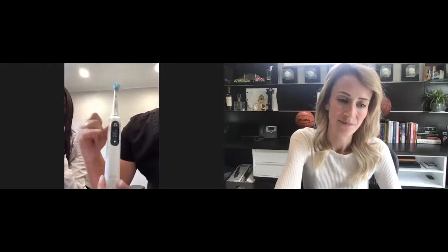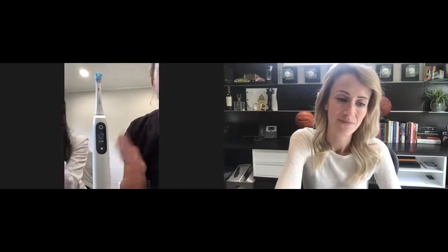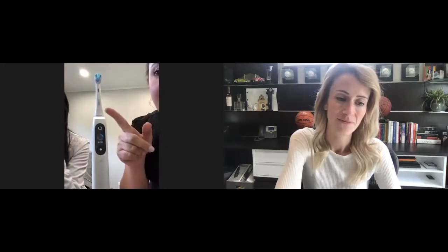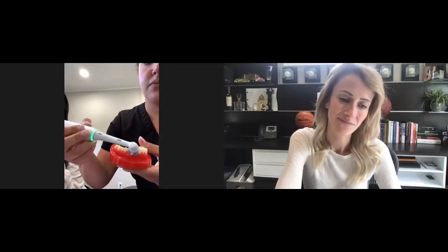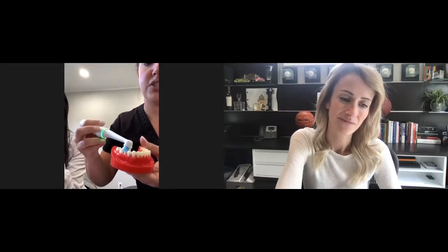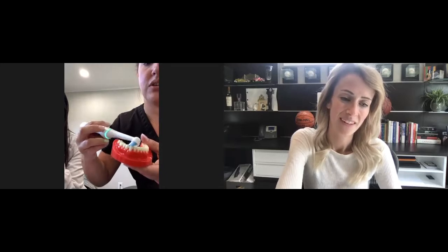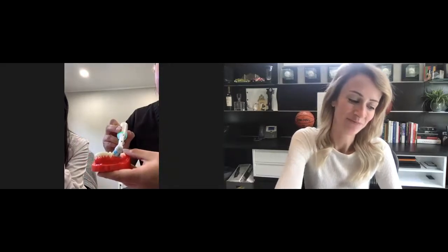Second of all, it does have a timer down here as well. So this will time you for 2 minutes completely, but it also has that 30-second timer. I don't know if you just caught that, but it does a little buzz or pulsate every 30 seconds. You're going to angle it right along the gum line, with a nice amount of pressure, and you're just going to slowly go in one quadrant for 30 seconds until the brush tells you to switch. I don't know if you caught that. Yeah. But then you're going to switch to your other area.